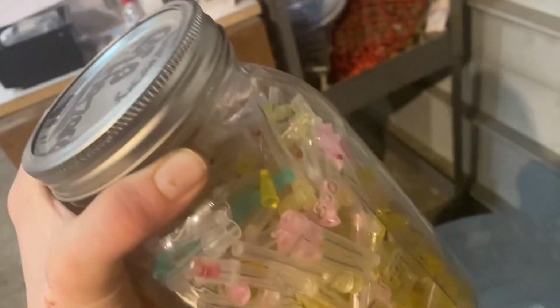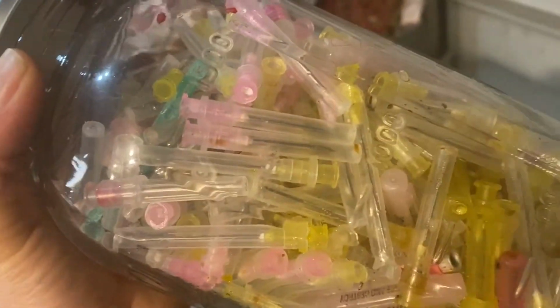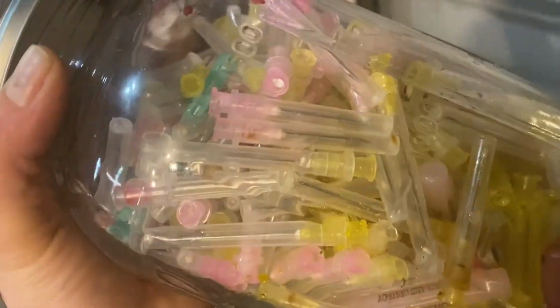We're also going to want to have a sharps container, someplace pre-designated to put your biohazard material such as your needles into, and have that set up ahead of time.